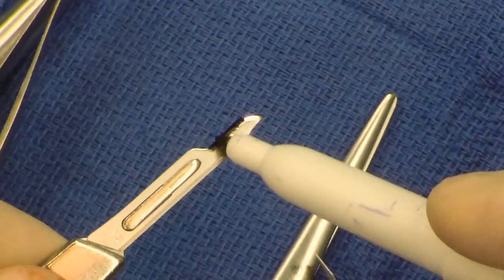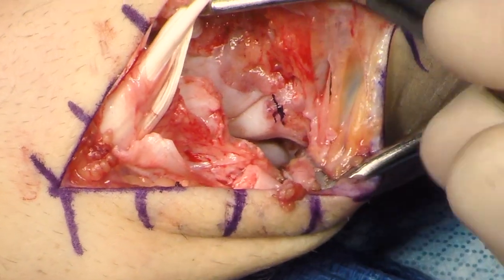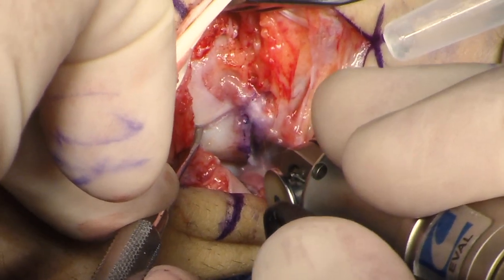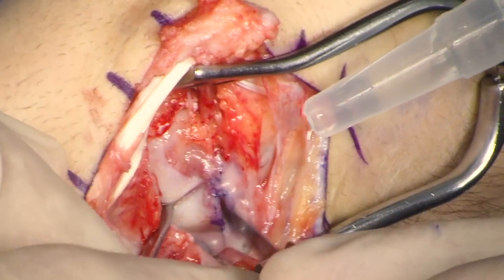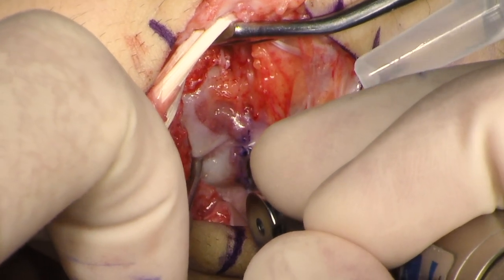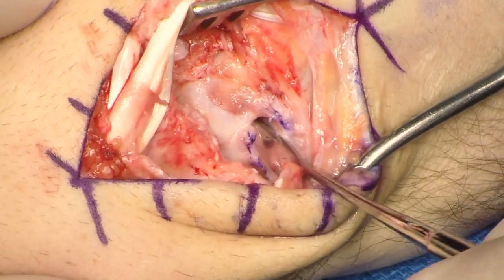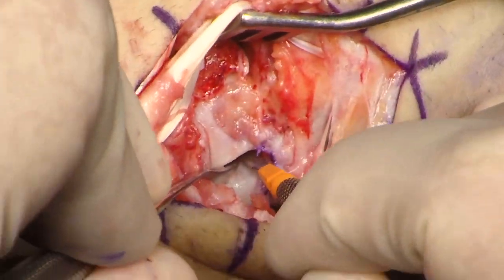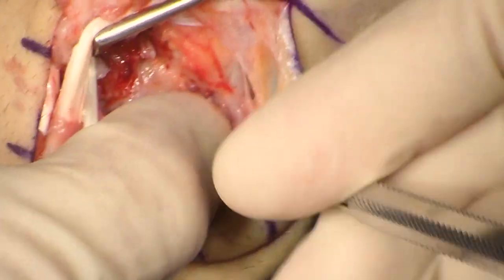Ink is then placed on the 15-blade scalpel, and the osteotomy location is marked on the hamate — in this case, 10 millimeters. The osteotomy is then performed with a thin sagittal saw with saline irrigation, going up to but not through the volar cortex. The freer elevator is then used to crack the volar cortex. Capsular division is then completed and the graft is gently removed.